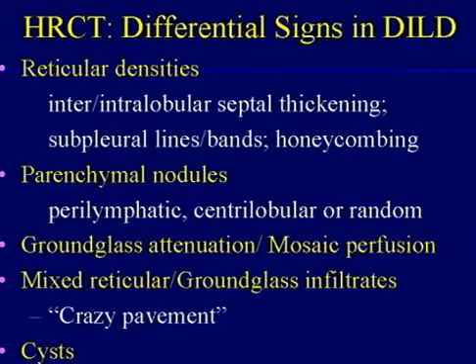We don't do that routinely, but there is no question whatever that doing expiratory images in the appropriate setting, someone where you think there may be air trapping or small airway disease, is an essential component. I know Rick Webb, for example, I think does routinely 3 or 4 expiratory images in every single case with just 1 millimeter axial images. We haven't done that. We didn't think the yield was high enough, but it's certainly something you should think about when you're looking at your images.